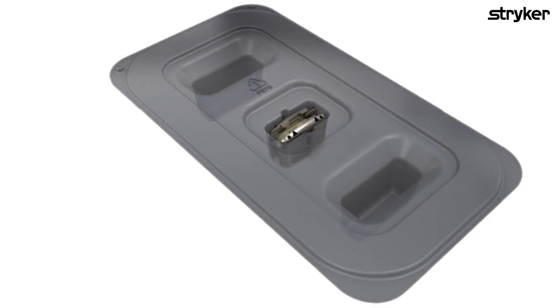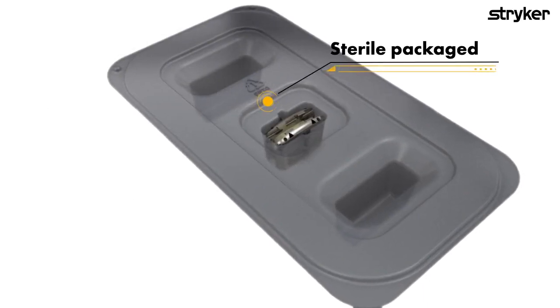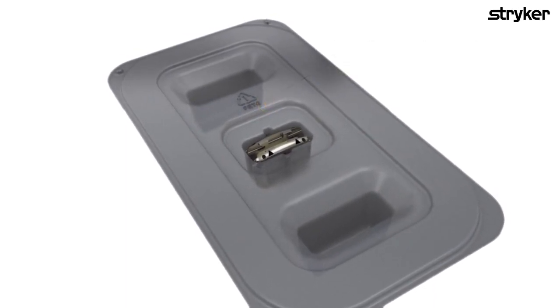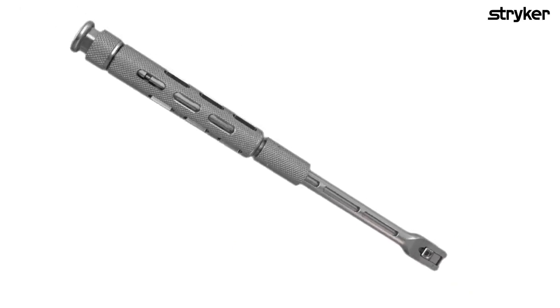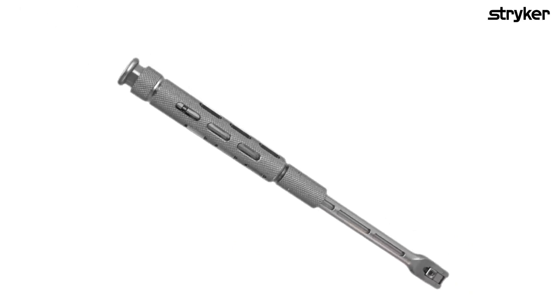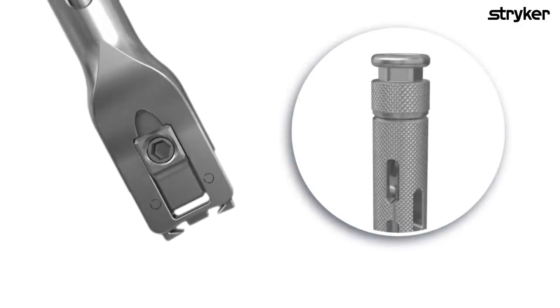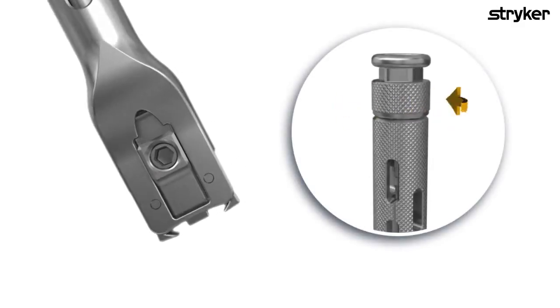Rhine cervical discs are individually sterile packaged and designed to facilitate easy loading of the disc onto the cervical disc inserter. To begin implantation, load the disc onto the inserter by first ensuring the grips of the inserter are fully opened. Grips are opened by rotating the proximal knob on the inserter in a counterclockwise direction.